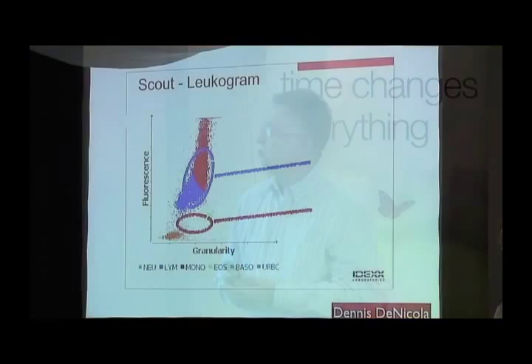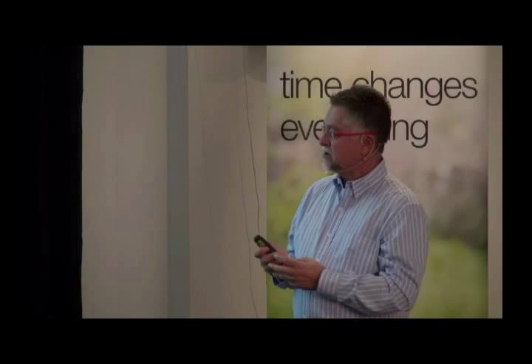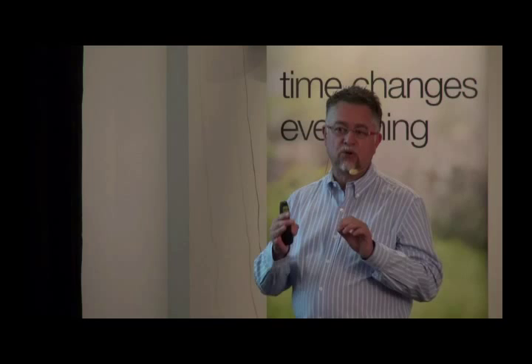The instrument will do two things to catch our attention, all right? And with the new software, it will tell you bands suspected. First, you see that there is a straight line in between the two populations as opposed to being separate clouds. This is the instrument telling you, you know what, I'm having a little difficulty with this cell. I know you don't do this for a living, I know you do not use the microscope, but could you please look at the blood smear to see if I am really a toxic cell or a band?